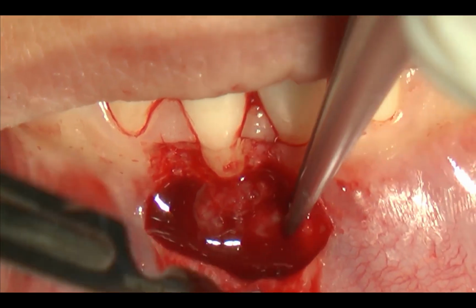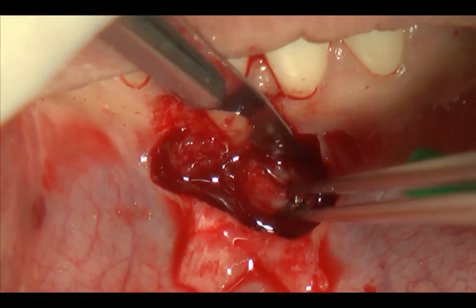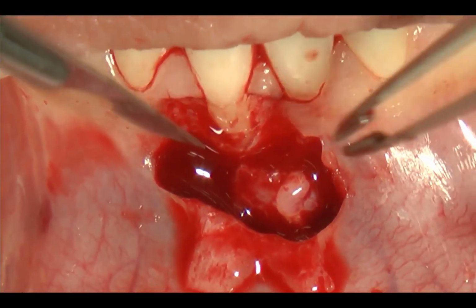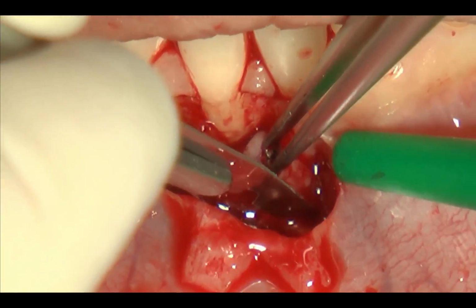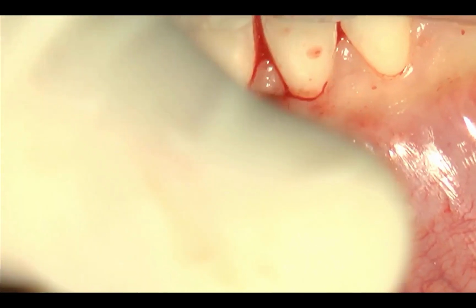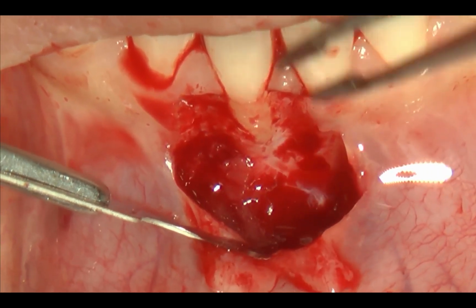This submucosal tissue is made of fatty, glandular, and muscle tissue, and thanks to the removal of this tissue, we will expose only periosteum in our vascular bed, right? Now you have to look inside your bed.